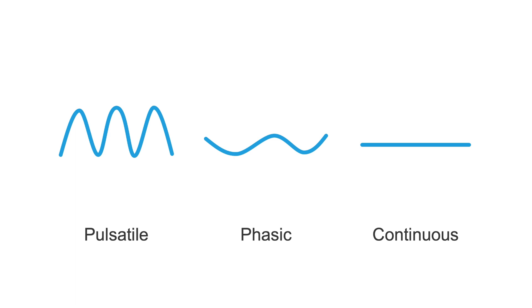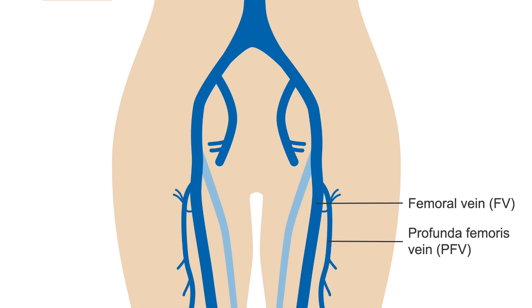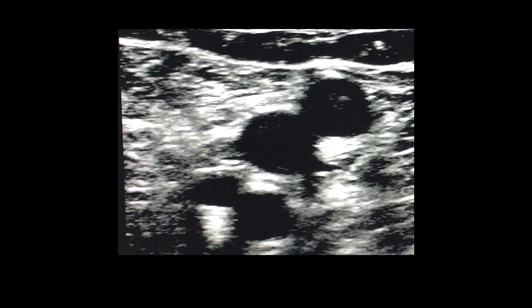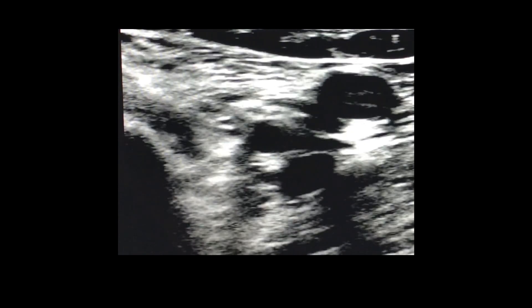We will discuss this in detail in the interpretation lesson. You will be able to see the confluence of the profunda femoris vein, or PFV, and the femoral vein, or FV, just distal to the CFV. In transverse, this will look like four circles: the profunda femoris vein adjacent to the profunda femoris artery, or PFA, and the femoral vein adjacent to the superficial femoral artery, or SFA. Compress these in transverse view and note both veins coapting.